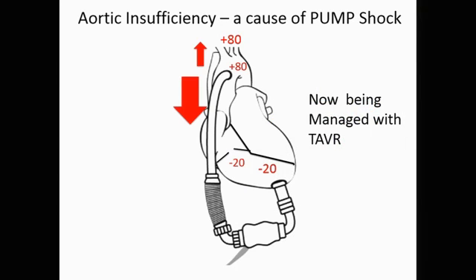Finally, the last thing that you need to know about is aortic insufficiency, which is an insidious and still difficult to diagnose complication of having these devices.